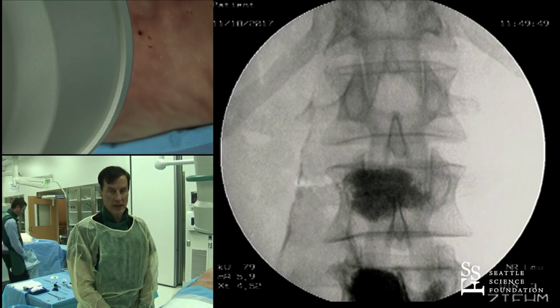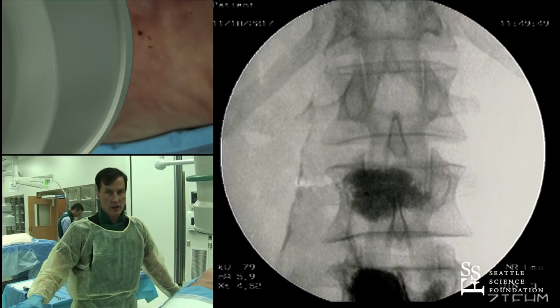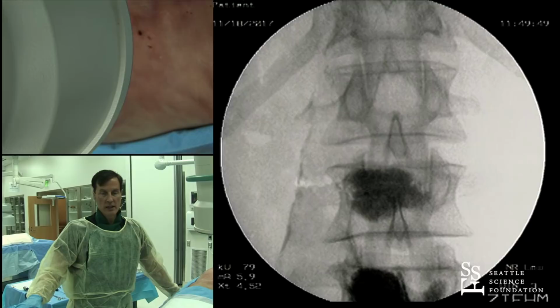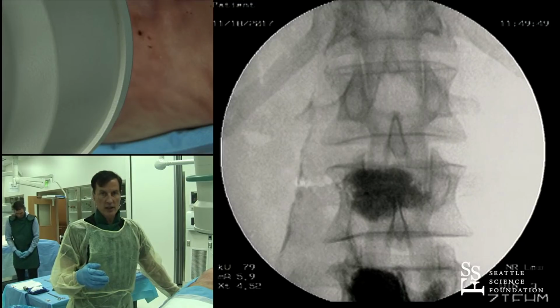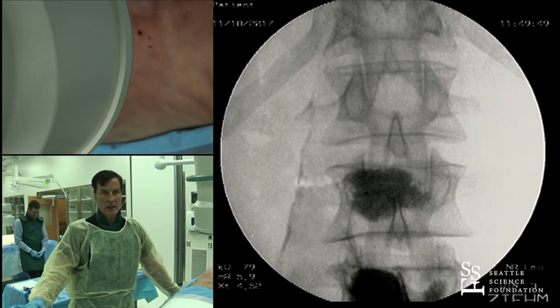Extravasation into the canal matters. Don't do it. Go back in and blow your balloon up, or wait. Go back on the other side. Wait till it hardens, and it will automatically plug. It hardens at a faster rate inside the body than it does on the back table. You can go back and add more cement, or you can go back through the same needle after having used your balloon to reinflate using the eggshell technique, thinning the cement out, causing it to harden and plug the leak, and go back and fire away with some more cement.